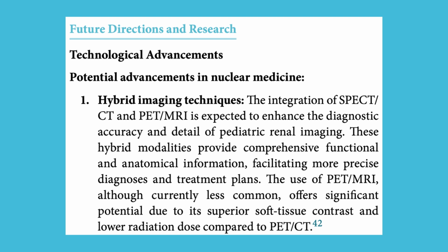Future directions and research. Technological advancements. Potential advancements in nuclear medicine. 1. Hybrid imaging techniques. The integration of SPECT/CT and PET/MRI is expected to enhance the diagnostic accuracy and detail of pediatric renal imaging. These hybrid modalities provide comprehensive functional and anatomical information, facilitating more precise diagnoses and treatment plans.